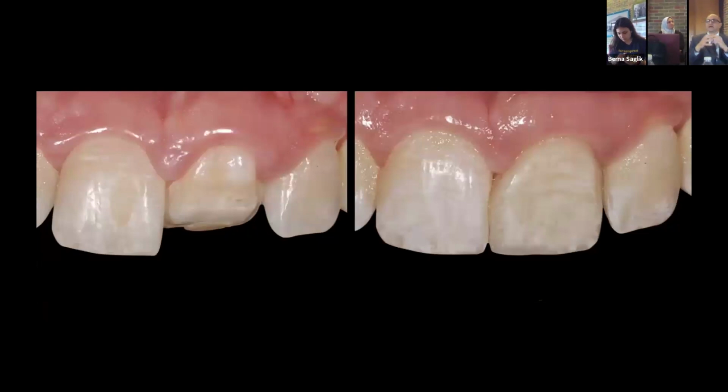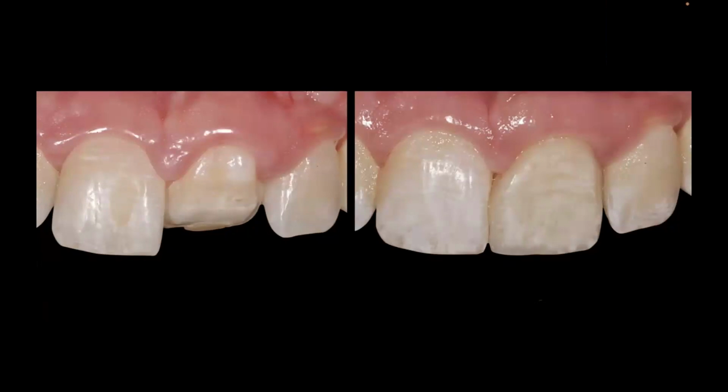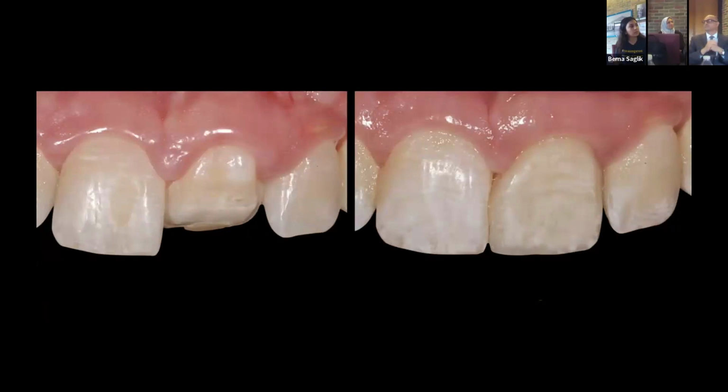Look at one case here. That case is an extensive, what they call it, basically when the crown and root are not at the same angle. So ortho couldn't do anything about that case. However, it does not interrupt the occlusion. So the only option was removing it and replacing it with an implant. In a 17 year old young man, I'm not going to do that. I'm not sure that, with implant dentistry after extraction, I can have enough bone to provide a beautiful restoration. So the other option was a very conservative veneer, and that's on the left side, done with lithium disilicate. Now, if we extend that treatment to use zirconia, we definitely need to make sure the bonding is strong.